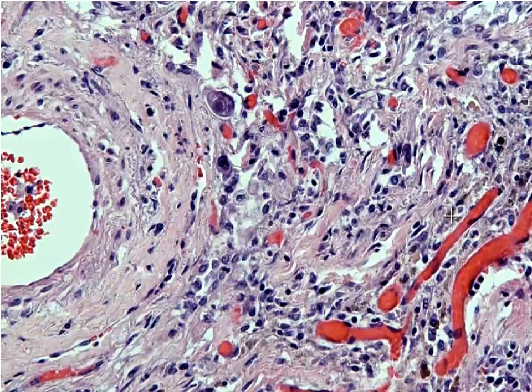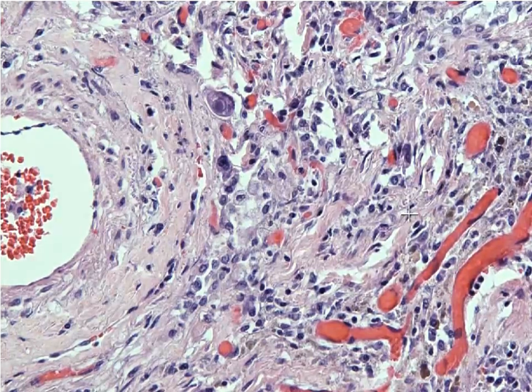Interestingly, we have another cellular accumulation. Here we have hemosiderin, and you can tell because it's a brown granular pigment. We do often see that in the lung, especially in older patients that have congestive heart failure. So this is an example of acute and chronic inflammation with necrosis secondary to CMV pneumonitis.